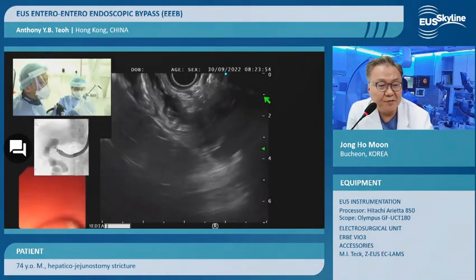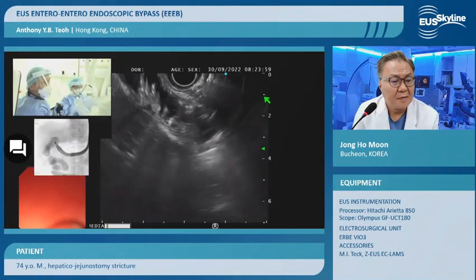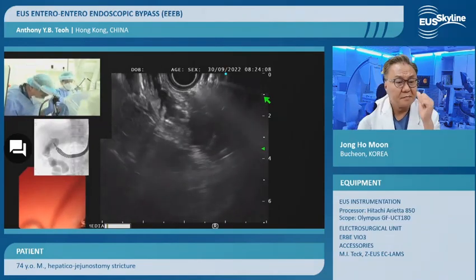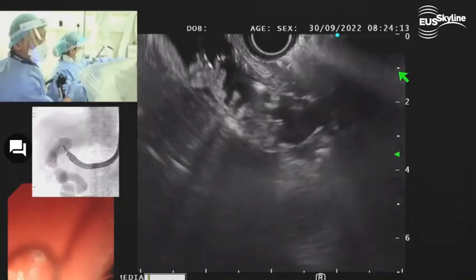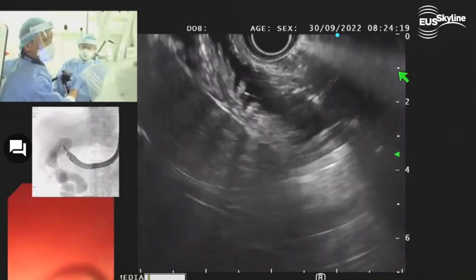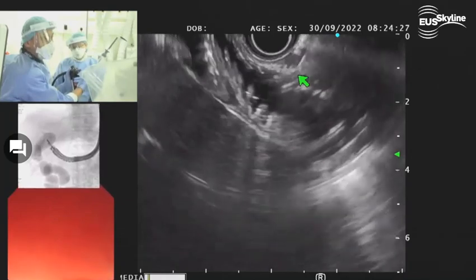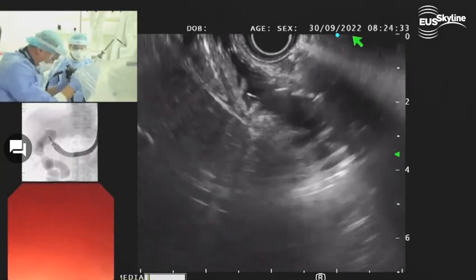Could you change the, yeah, great, great. Okay. All right, so if I push here, then it will push the delivery system out. I'm not getting a really great ultrasound image. My position may have changed a little bit. I think my delivery system should be somewhere around here. If I move forward, you can see me moving. Yeah, that's my wire. You can see there. Yeah, okay, perfect.